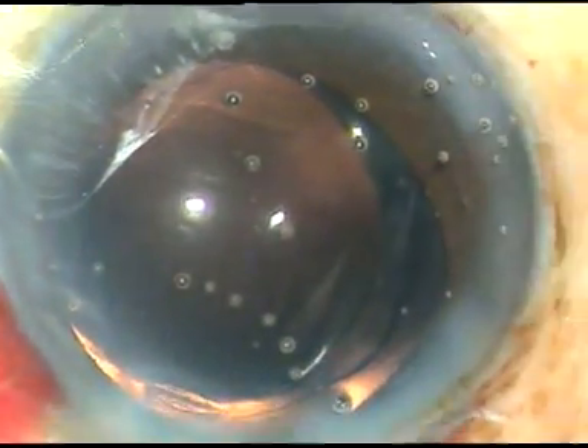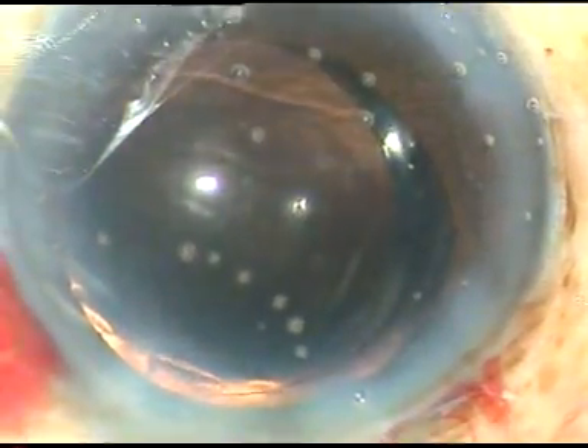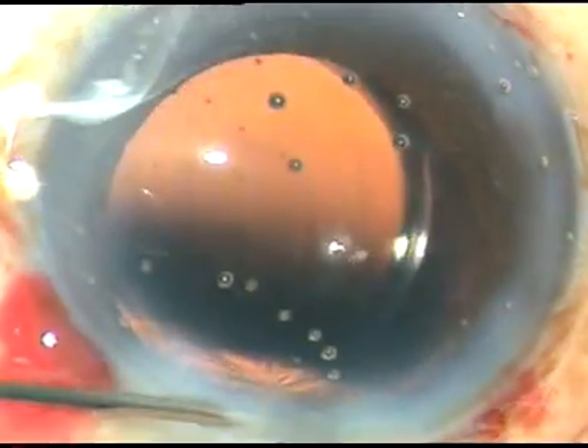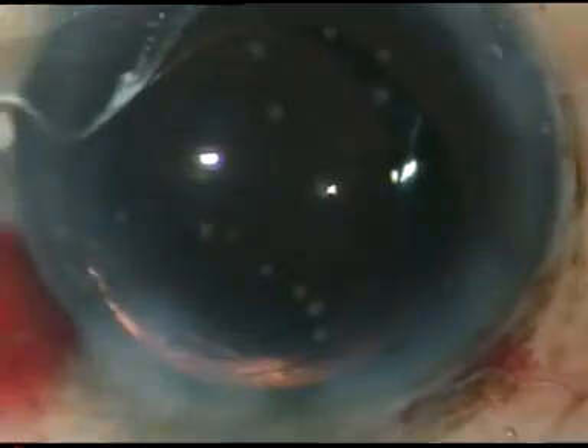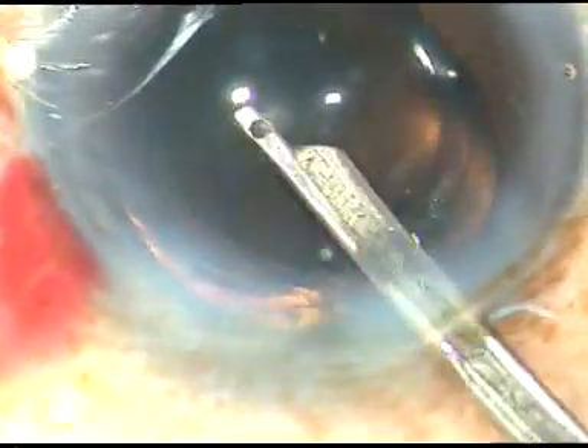The case is essentially done, but there are a few more steps. This is moxifloxacin. The side ports are to be closed — hydration of the stroma on either side of the side port closes these wounds. Some viscoelastic substance is sticking to the corneal endothelium; going in with the Simcoe cannula and flushing dislodges and removes it. Hope this video will help you in managing your intumescent cataracts.